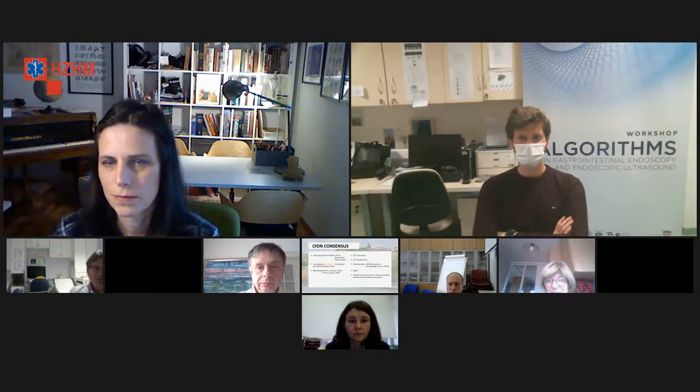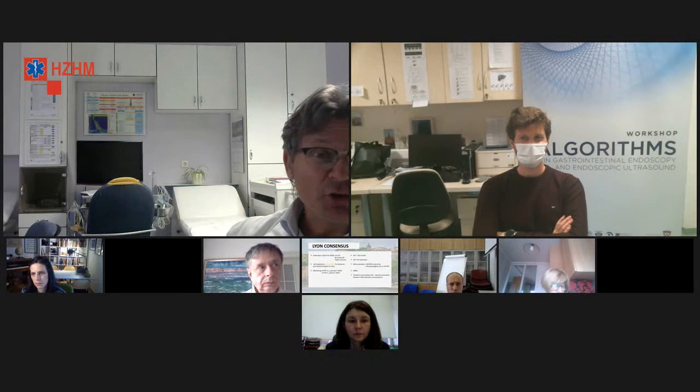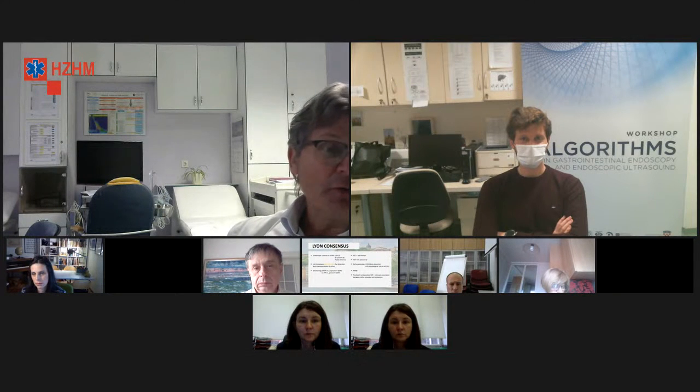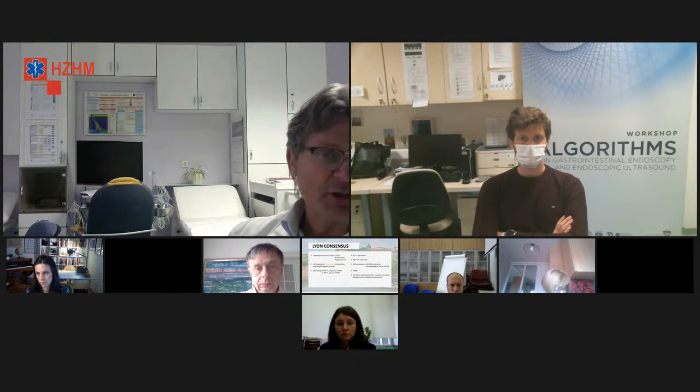Bog, ovako, ta priča, idealno bi bilo normalno dvokanalni pH, čak vidjeli smo na onim, i postoji trokanalni pH plus sa impedancama kateteri, ali ta priča je jako skupa. I tu, ne znam, taj dvokanalni pH kateter je 3-4 puta skuplji u odnosu na jednokanalni sa impedancom.